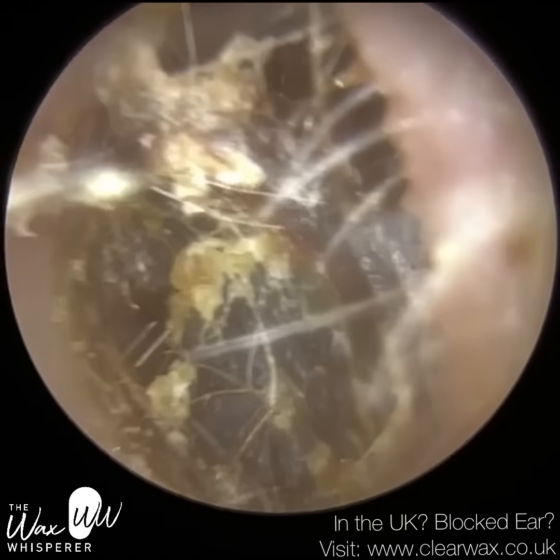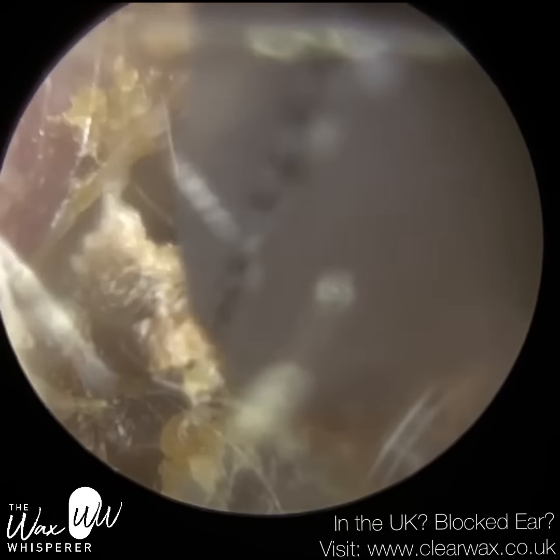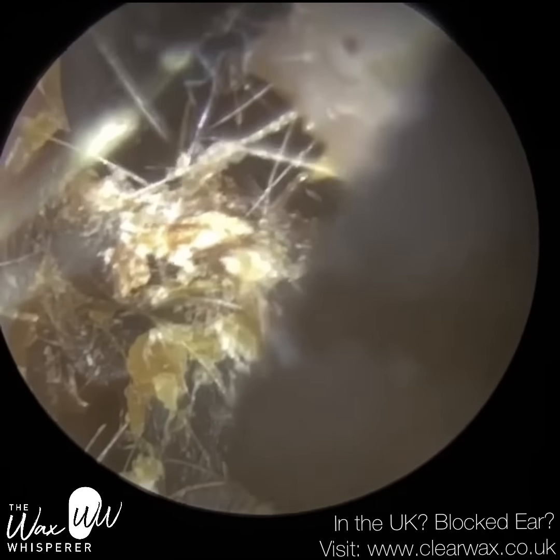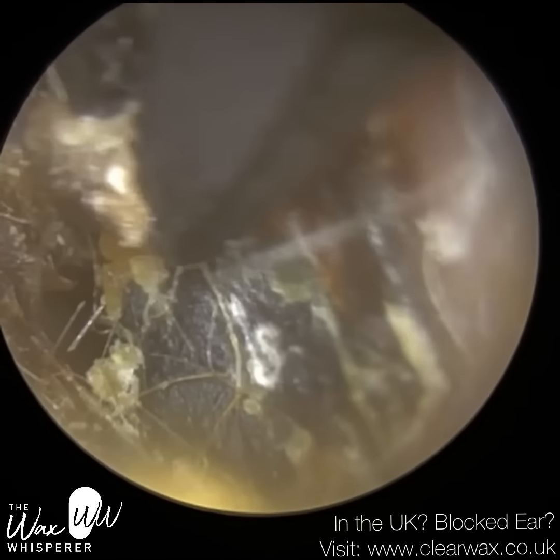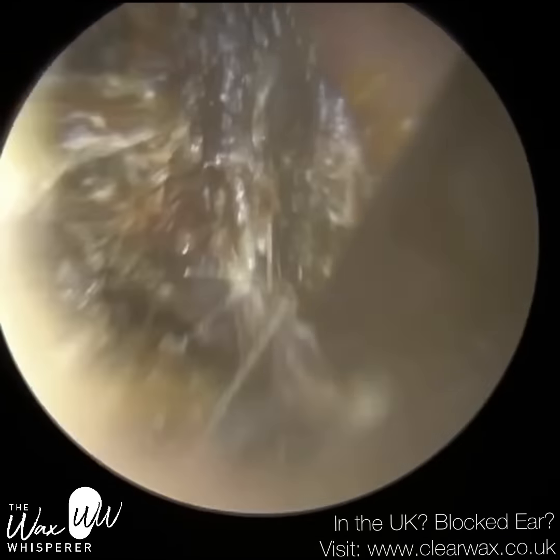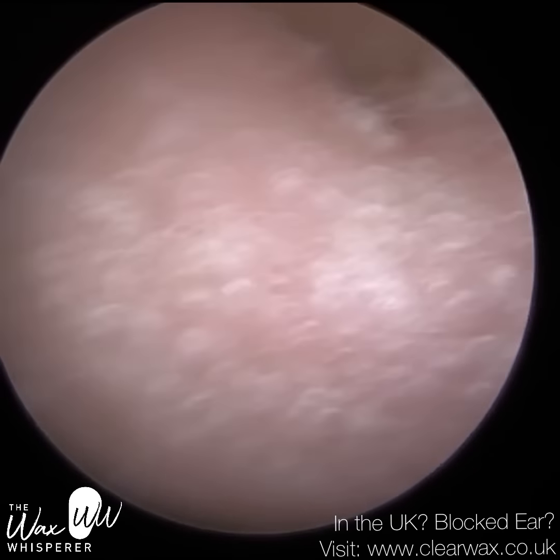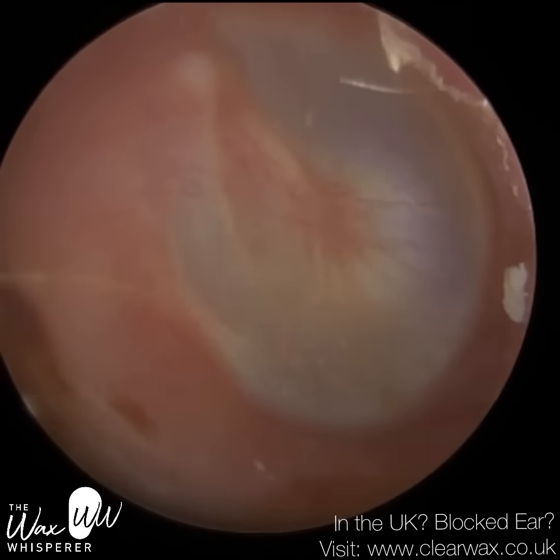Now I'm going to just use the forceps, I think, because there's something there for me to grab hold of at the top. It's protruding outwards. I'm going to just get a good grip, and now I'm just wriggling it. I just want to detach this from the canal wall. Again, bring it out slowly, and there we are. So it's quite a substantial plug of really dark oxidized skin and keratin.